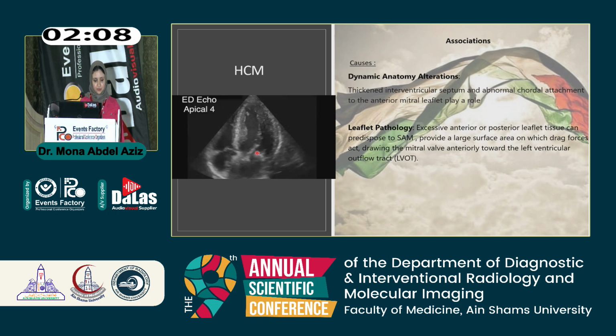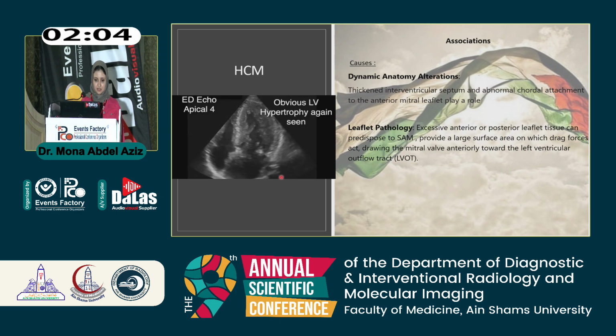This is a video that demonstrates the systolic anterior motion of the mitral valve. This is the systolic anterior motion again, of the anterior mitral valve leaflet towards the LVOT during systole.